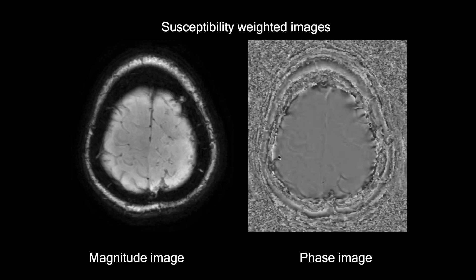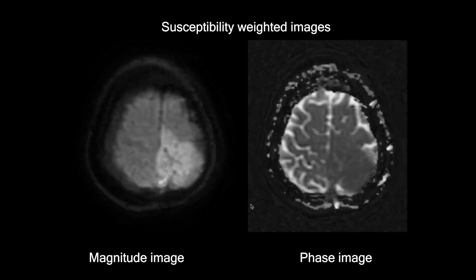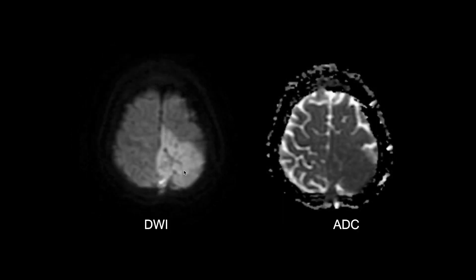On susceptibility weighted images, there is no evidence of hemorrhage or calcification within the lesion. On diffusion weighted imaging, the lesion shows diffusion restriction with a corresponding decrease in the ADC value, reflecting the high cellularity of the tumor.